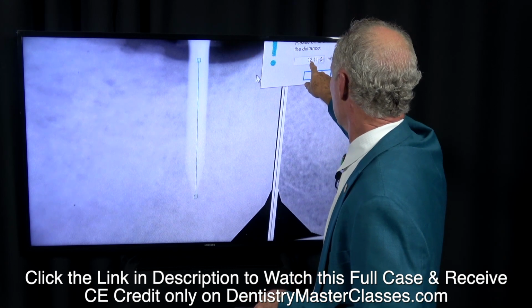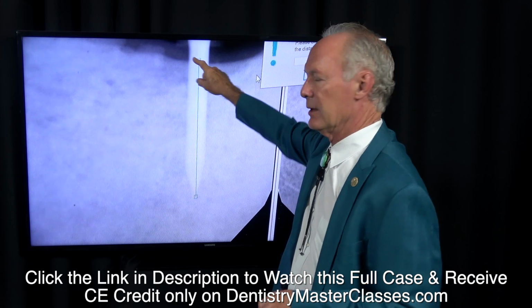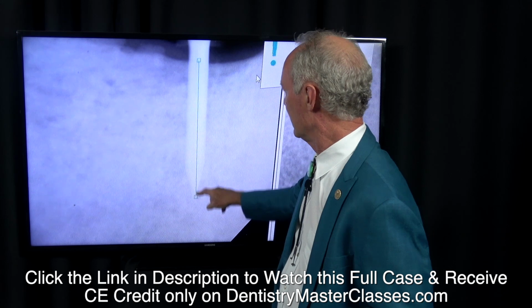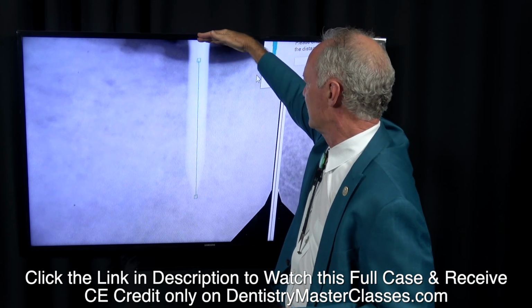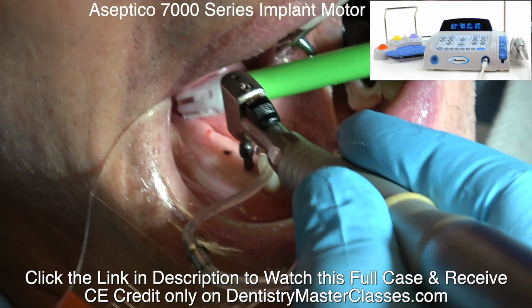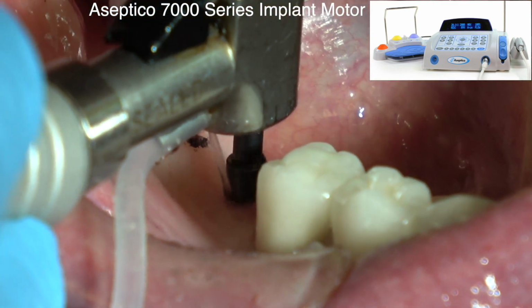So if this is 12 from here to here, what size drill am I going to use? A 14. 12 in the bone and 2 more in the tissue, because that shoulder of the drill is going to stop when it contacts the gingiva. So 12 is plenty.